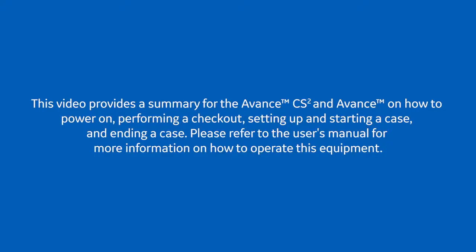This video provides a summary for the Avance CS2 and Avance on how to power the system on, perform a checkout, setting up and starting a case, and ending a case. Please refer to the user manual for more information on how to operate this equipment.